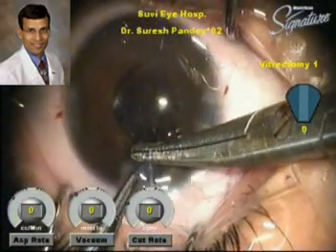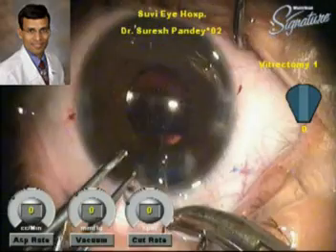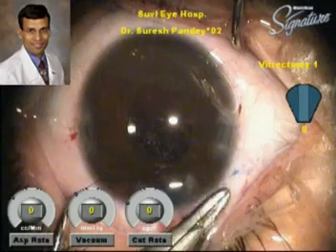Now, the incisions in small children should preferably be sutured because the low scleral rigidity causes fish mouthing of the incisions in the postoperative period, and the children tend to rub their eyes, which may also cause problems with the healing of these incisions.